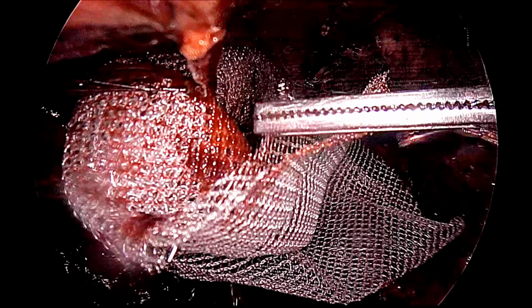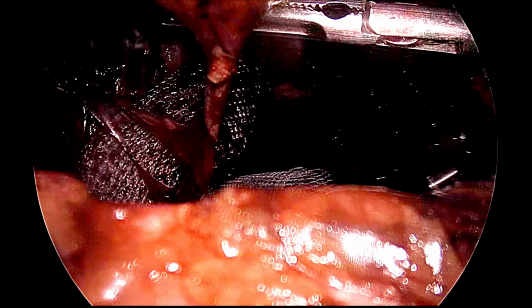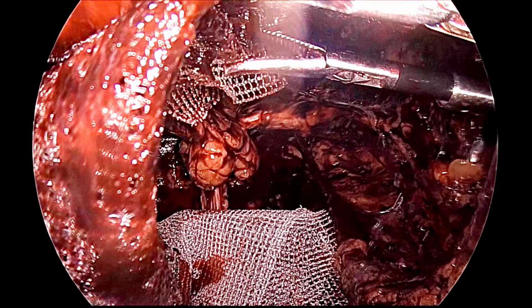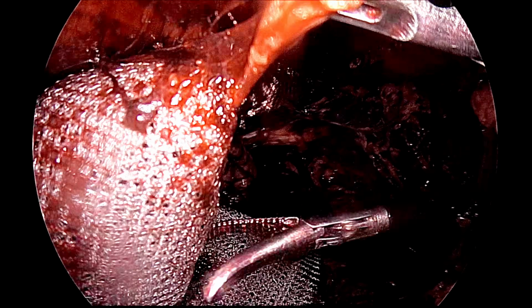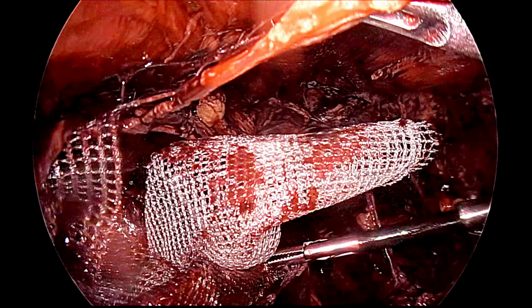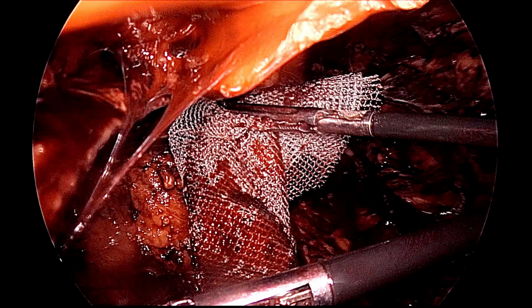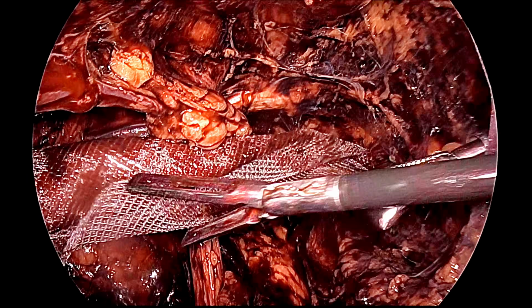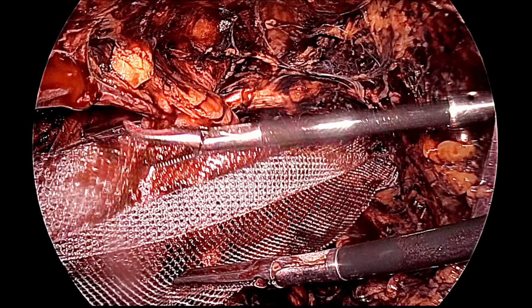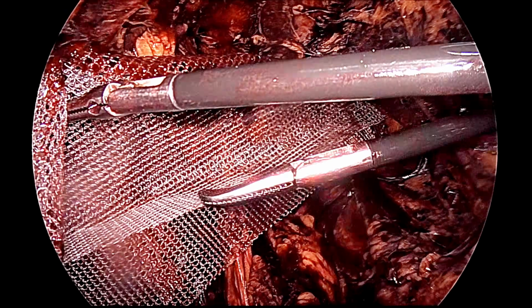And during that spreading, we have to take care that it should not be corrugated or make a bunch. It should be spread as nicely as possible, then it will be better. Another important point, the lower edge of the mesh should not fall over the peritoneum. Otherwise, once you remove the gas from the preperitoneal space, it will fold the mesh. So, half of the mesh should be on the anterior abdominal wall and half should be on the peritoneum. Otherwise, it will fold and recurrence will happen.